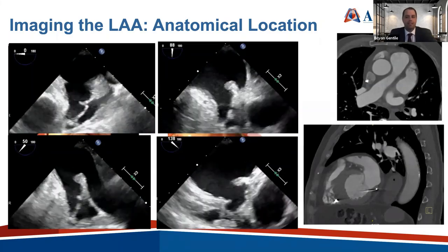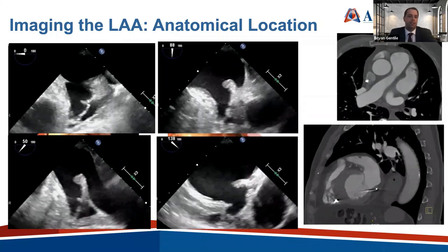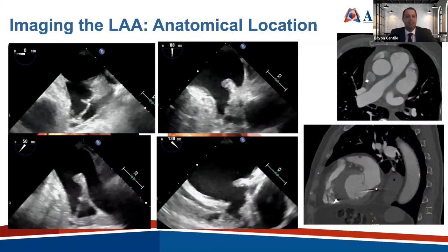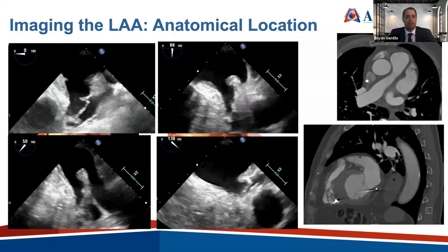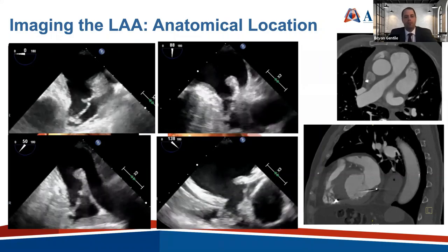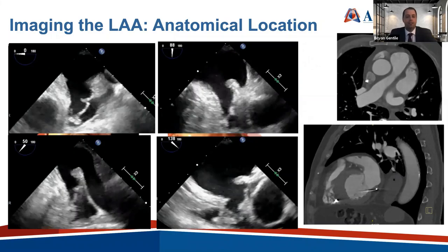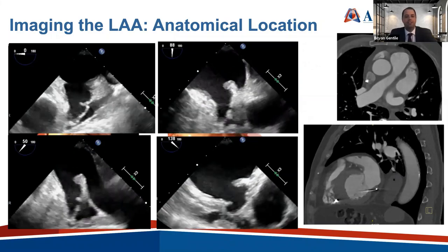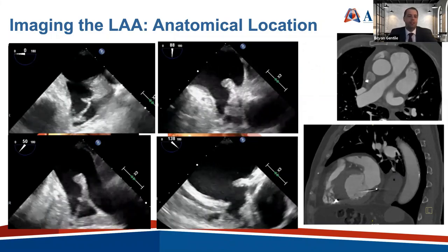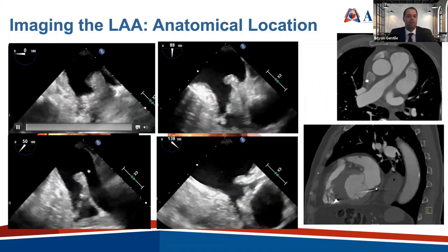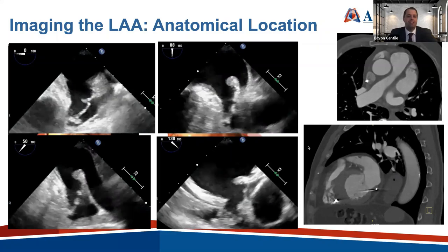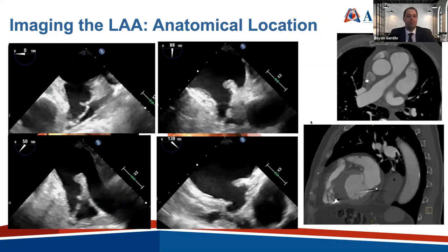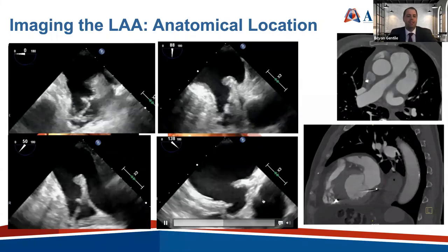I tend to image the appendage every 10 to 15 degrees and record an image at each interval when screening for pathology and looking for thrombus. When measuring the left atrial appendage, we typically take four different views: 0, 45, 90, and 135 degrees. This helps us understand the morphology. At lower angles — 0 and 45 — the appendage often looks like a windsock morphology. At the high angle view, we're cutting through the main part and can see more complex morphologies, including accessory lobes.